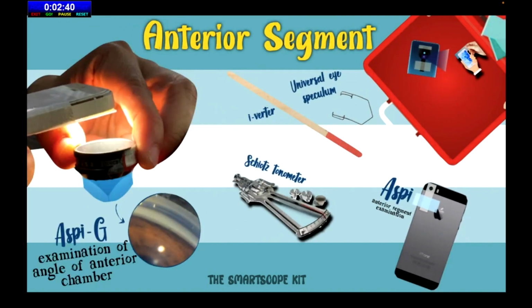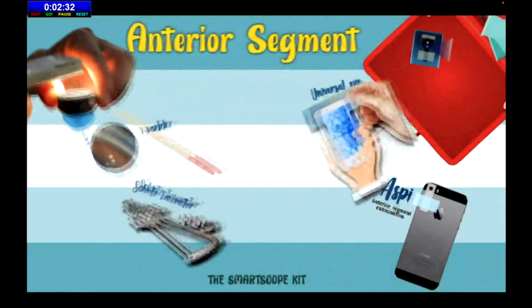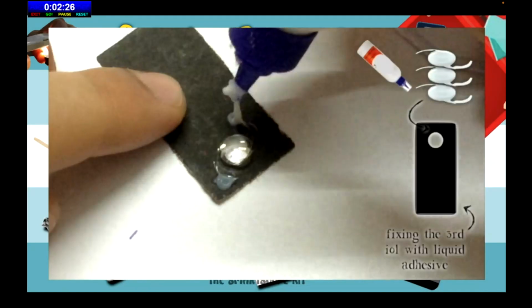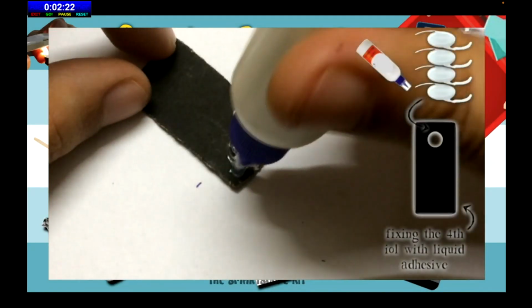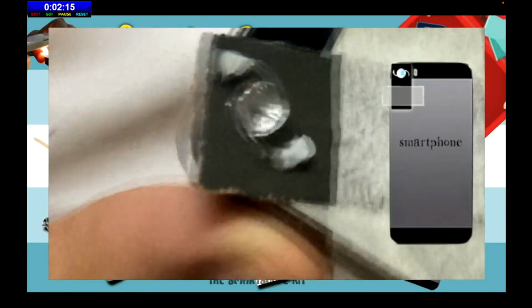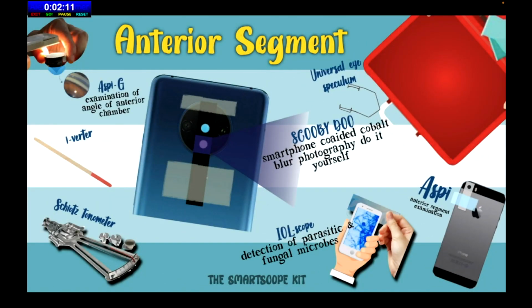All these we have been able to take without a slit lamp, and this can be done by anybody. And over here you can see how an 8 diopter IOL has been used to take this image of the angle recession. Just to mention the IOL scope, because it's there in the Smart Scope Kit: over here we use four 30 diopter lenses together, and we have been able to develop one IOL of 150 diopter also. Not that it's very important in trauma.